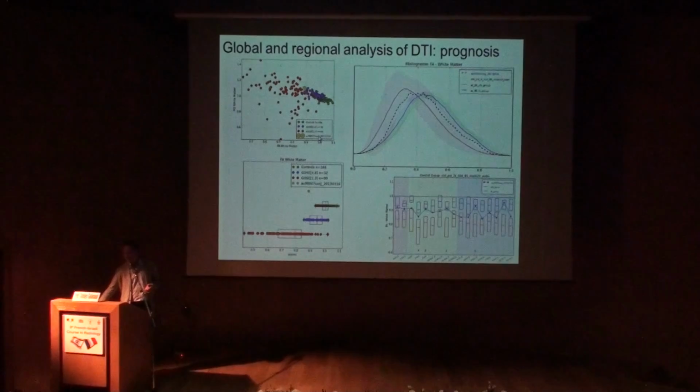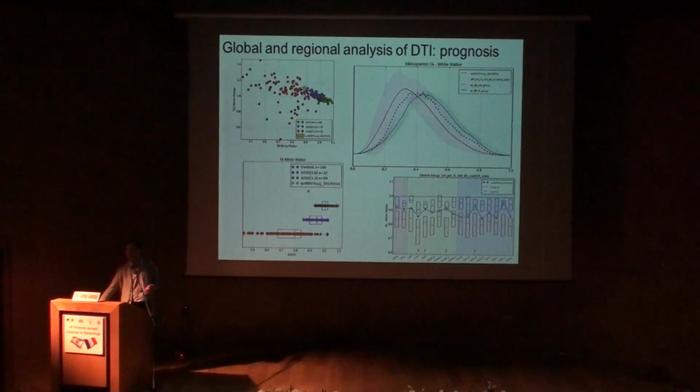You get these maps plotting the FA value as compared to patients with unfavorable outcome, favorable outcome, and controls. You get the distribution of the FA value in your patient as compared to patients with unfavorable evolution and favorable evolution, and then the system plots as best as it can your patient as compared to controls, patients with favorable outcome and patients with unfavorable outcome.